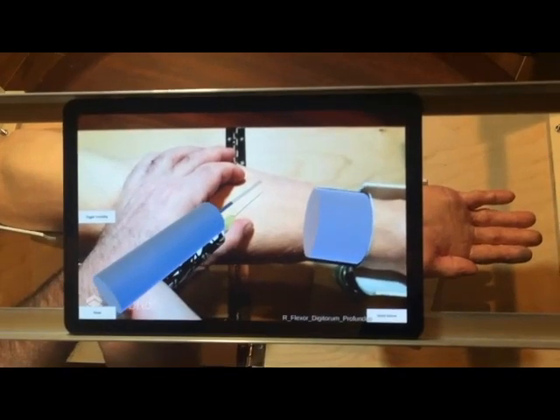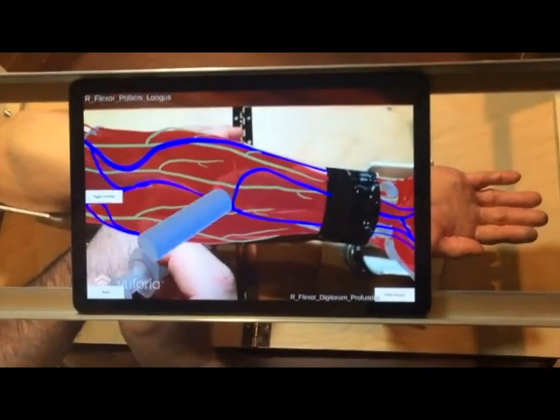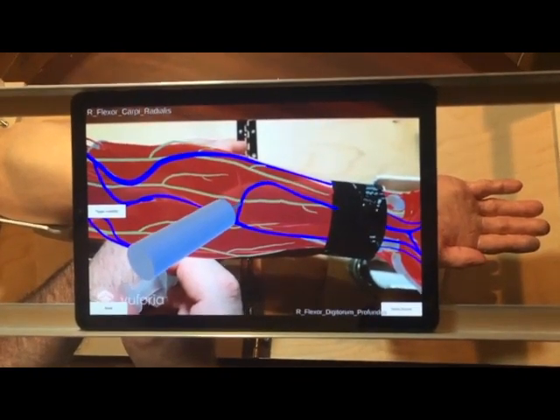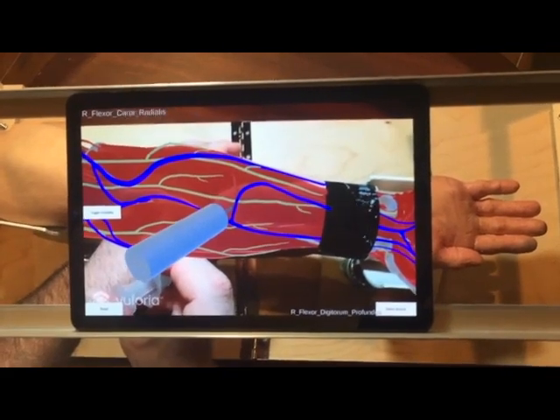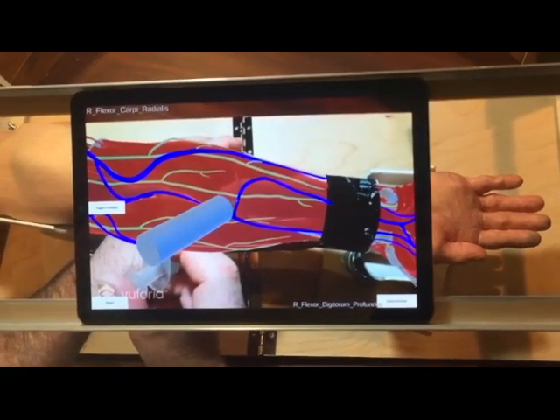Sync the syringe by allowing the tracking marker to be identified within the view of the tablet. Once synchronized, the virtual syringe and needle will superimpose over the view of the physical syringe.